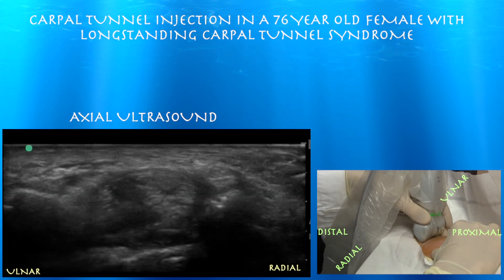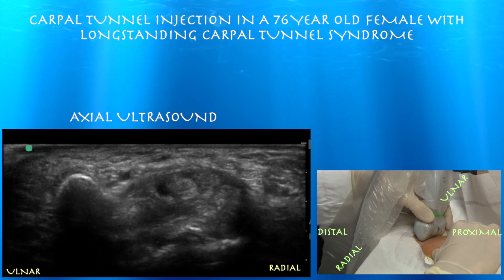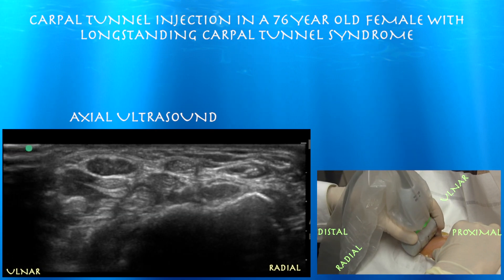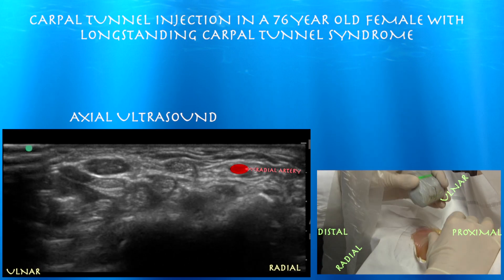Here's the pisiform. You can see the ulnar artery and the ulnar nerve right next to it, between the artery and the pisiform. If we go to the radial side, you can see the radial artery — and notably there is no corresponding radial nerve near the radial artery.